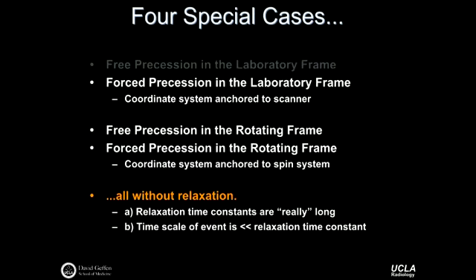They have these sine and cosine terms. And the Z magnetization, in the absence of relaxation, doesn't do anything, so it's kind of uninteresting. What I want to work through, we'll see how far we can get, I'd like to work through all three of these today. We may not get through the fourth one.